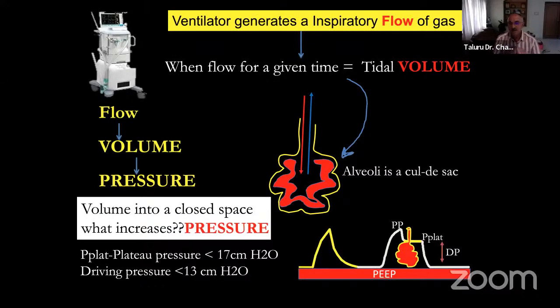So these are the lung protective zones. You may feel that it's being repeated, but I want you to take this information home, to your bedside, and start implementing it in your patients, so you are always in a lung protective zone. The plateau pressure in a normal lung under anesthesia could be 17. As I've said, if there is some pneumoperitoneum or a posture change and the plateau pressure goes up to around 20, 24, 25, then you have to think, is my lung all right?